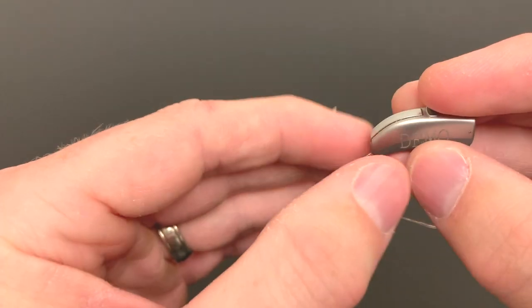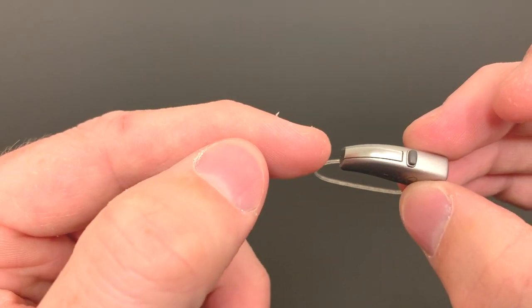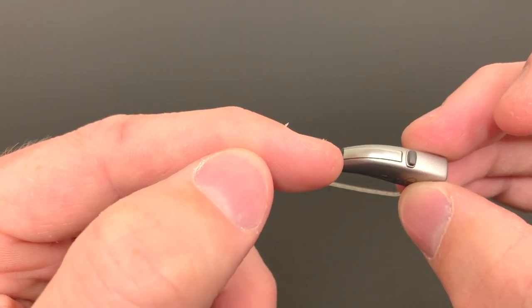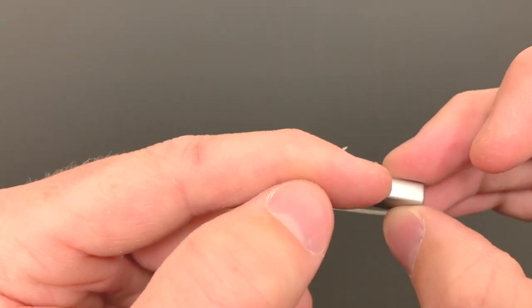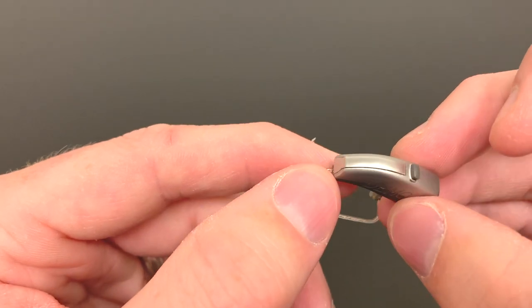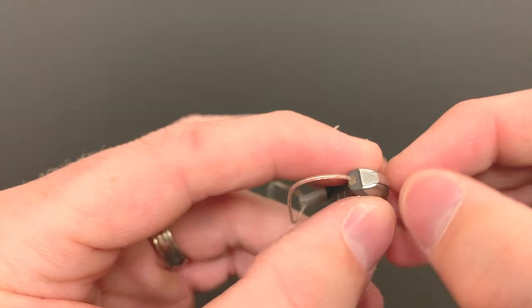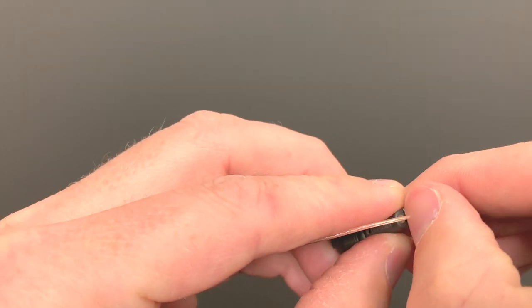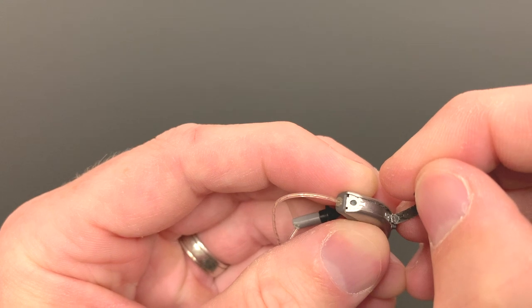You close the battery door and go around to the top. Microphones on most of these receiver in the ear or receiver in the canal hearing aids are here at the top. There's one here at the top and one here at the back. In this particular style of hearing aid, the microphones are covered by a protective cover. And if we were to take that protective cover off like so, you would see underneath that there's the microphone ports there.